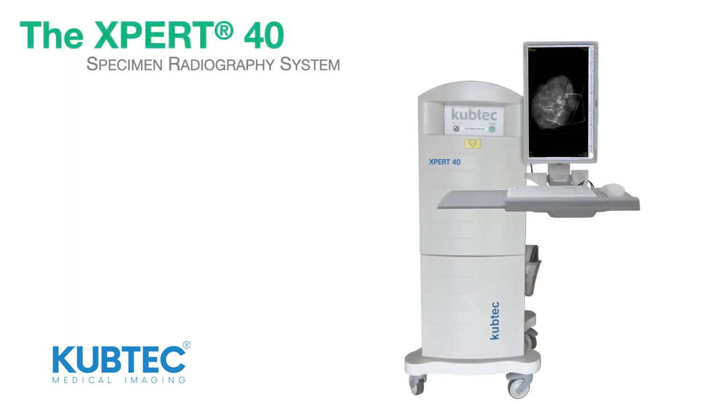The system features a mobile cart for maneuverability and a touchscreen option for convenience.